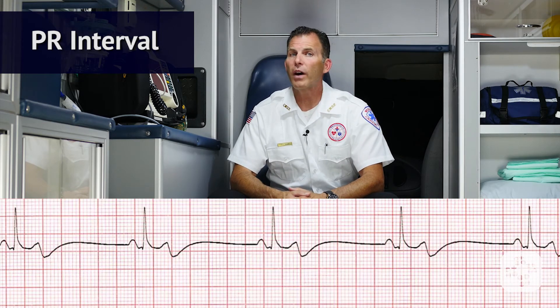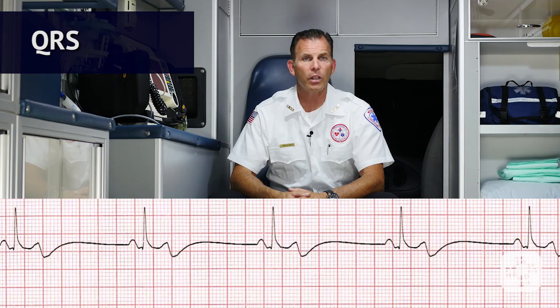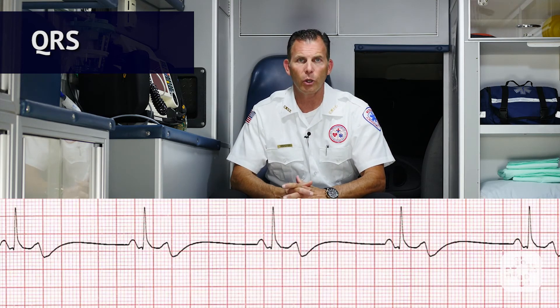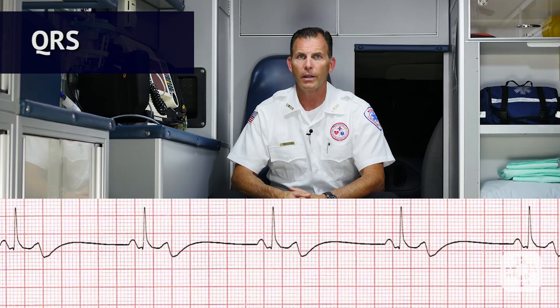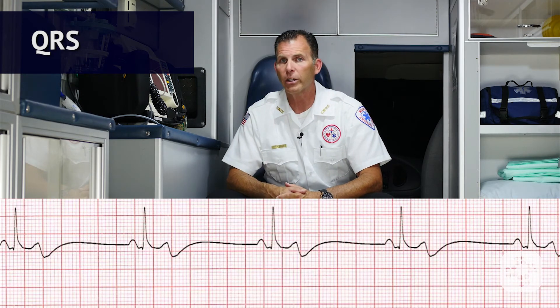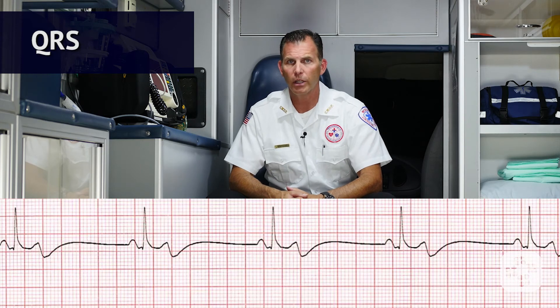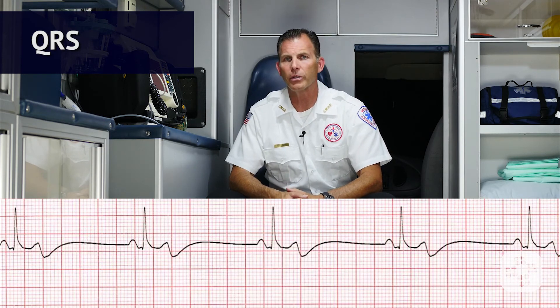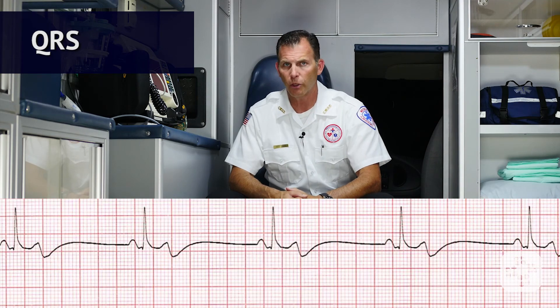Now we move on to the QRS complex of the ECG. Is the QRS interval less than 0.09 seconds? Yes, the QRS interval is less than 0.09 seconds. Is it wide or narrow? In this case, the QRS is narrow. Are the QRS complexes similar in appearance? Yes, we can see that each one looks similar.